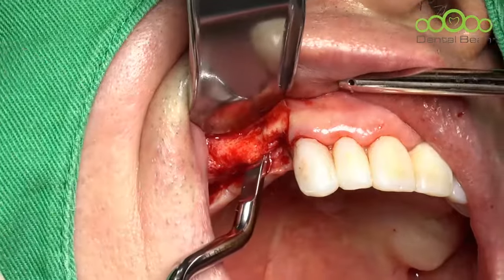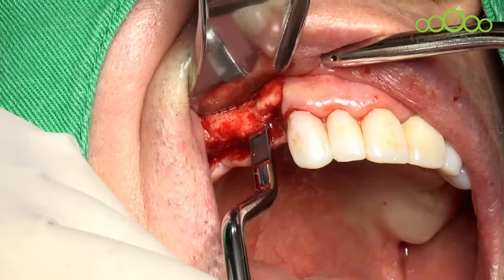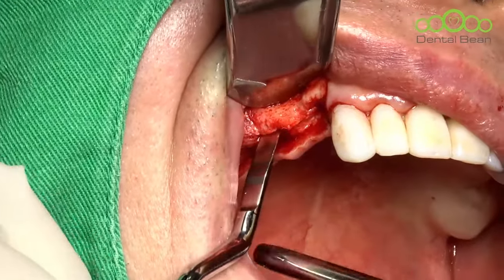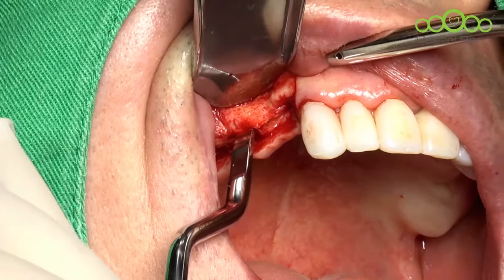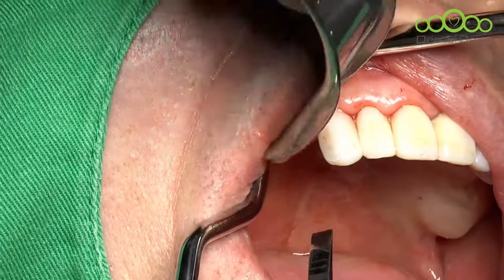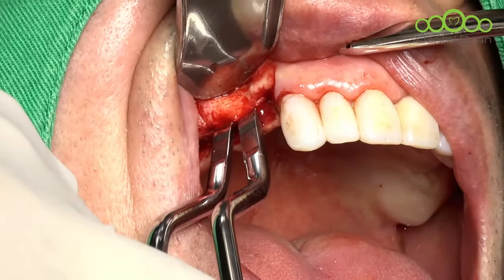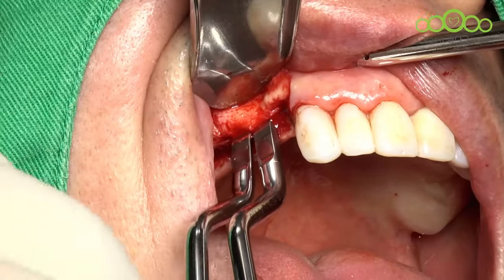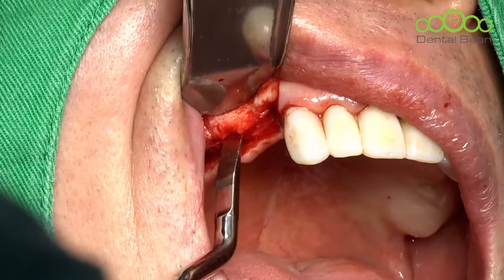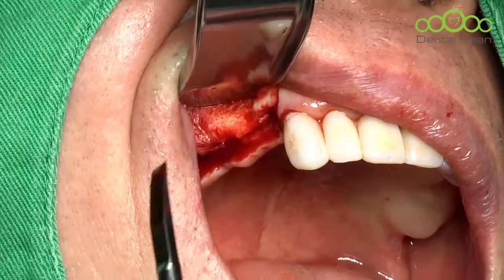It's dense bone, like this. Okay, gradually, under gentle hammering, try to split the ridge. This patient has relatively dense bone. And this is a 2.0 split chisel. I will use this one to split the ridge. Okay, then remove first. Next here. Very dense bone. Okay.